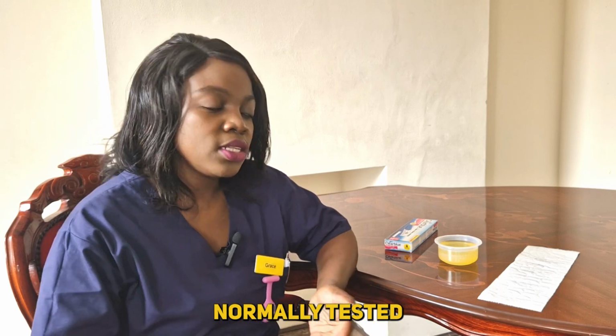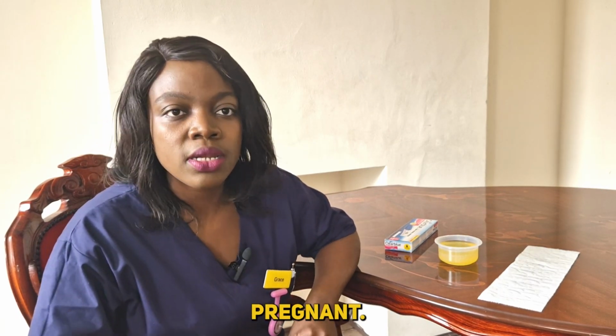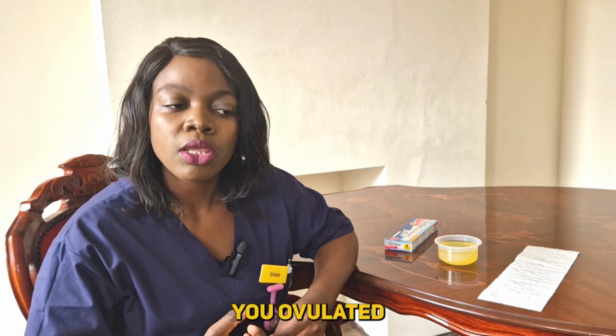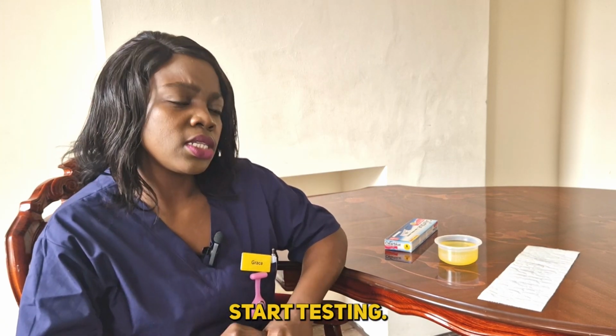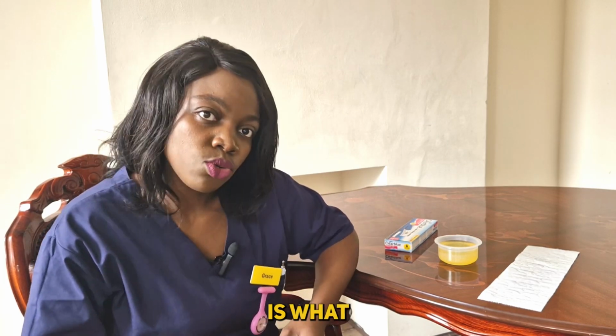HCG is what is normally tested in the urine or blood. When it tests positive, it means that you are pregnant. When it's negative, it means that there's a high possibility that maybe you ovulated late and your implantation happened late, and therefore your HCG is not at the right amount for you to start testing, or there's a high possibility that you are not pregnant. So that is what happens.